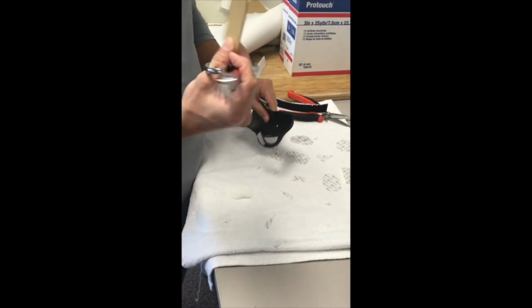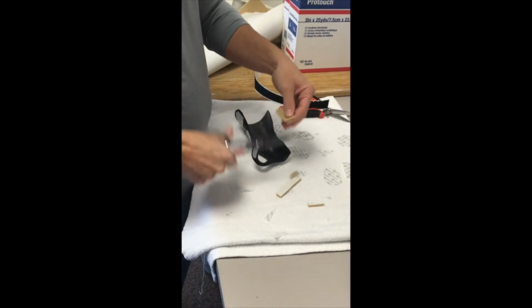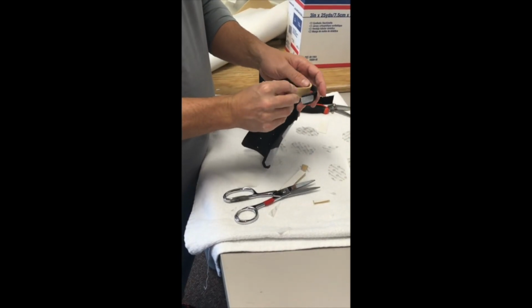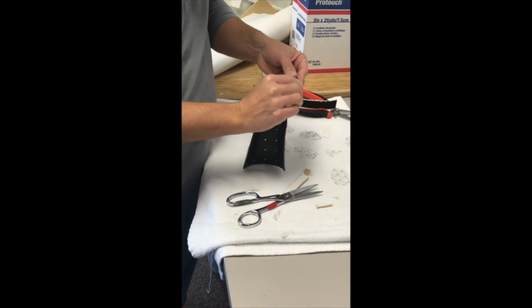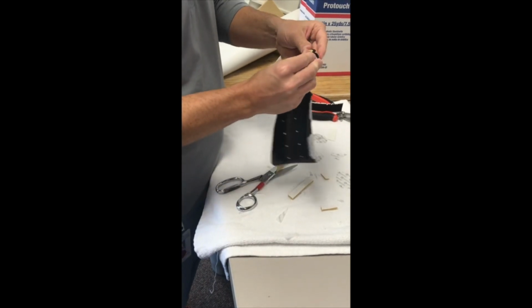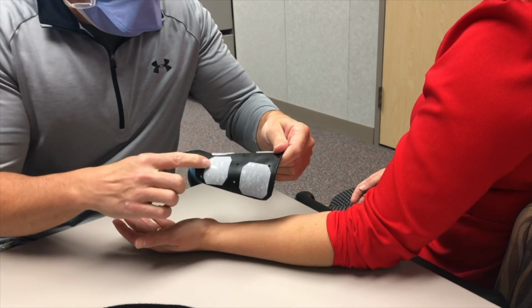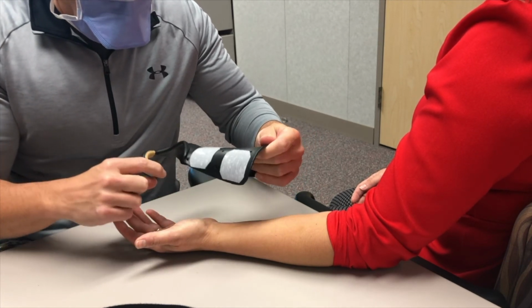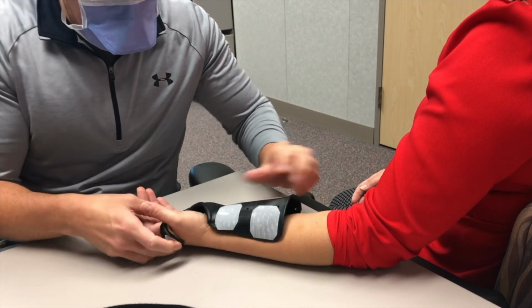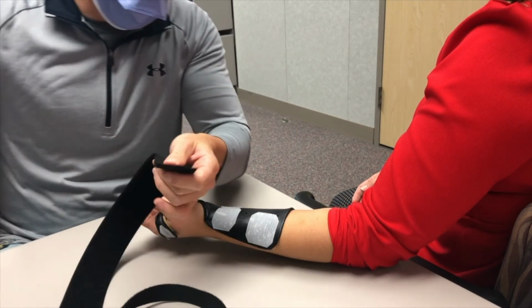In our splinting lab, we will not have access to closed cell foam, but in a clinical environment, you may or may not want to choose to use closed cell foam on your tab in order to increase comfort to the dorsum of the hand. That is a personal preference, which maybe we will leave up to you as clinicians. So, after we've placed our Velcro strapping, as well as some closed cell foam, in order to provide some padding over the dorsum of the hand, we will apply the orthosis to our client with our strapping.